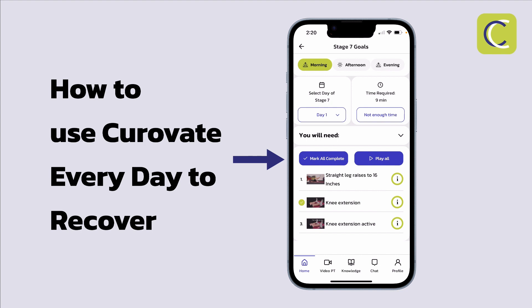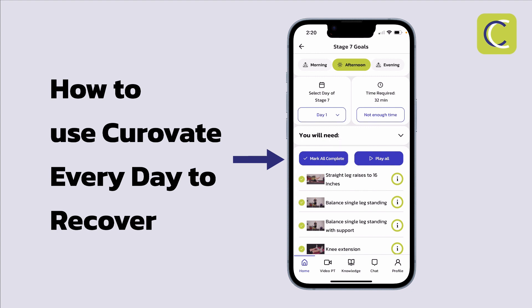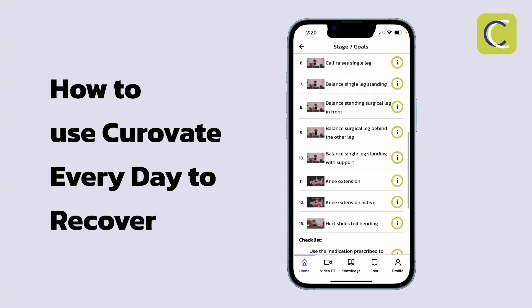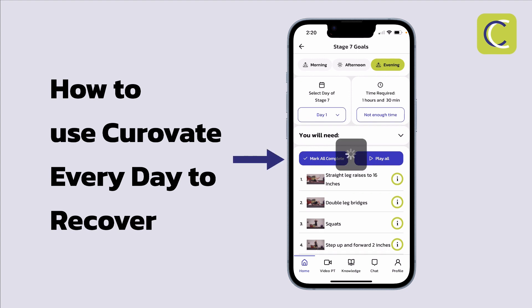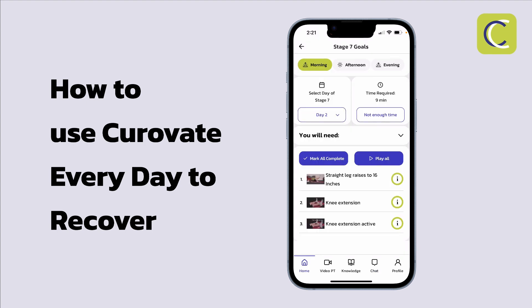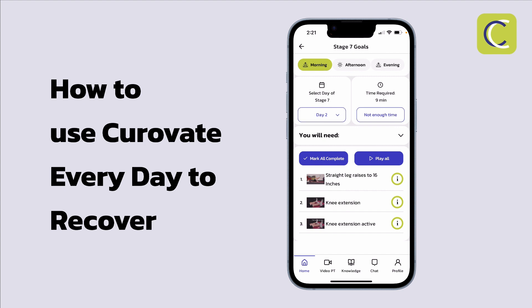The way you progress from day to day: I come to my morning session, mark everything as complete with this button, and it moves me to the afternoon. I complete all my afternoon exercises and checklists, press mark as complete again, and Curovate automatically moves me on to the evening session. Once I've completed all the evening exercises, I mark as complete again. After completing the full day, Curovate rewards me with a badge and asks if I want to move on to the next day. Once I press yes, Curovate automatically moves me to day two.